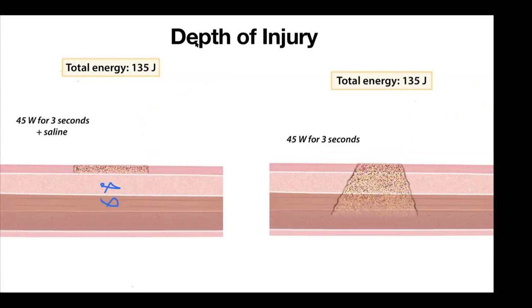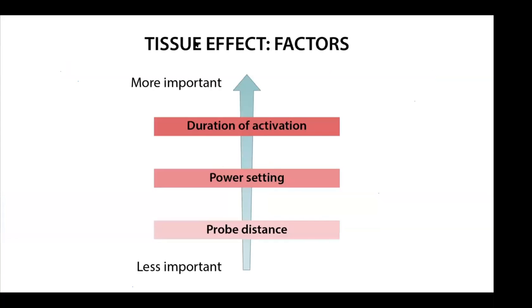And when you have a patient with the angioectasia in the cecum, although it is very easy to apply APC and get out, take some time and create a submucosal bleb and protect your muscle and your submucosa from deep thermal injury. So we talked about all the concepts. So learn how to apply the minimum amount of APC to get the desired effect.